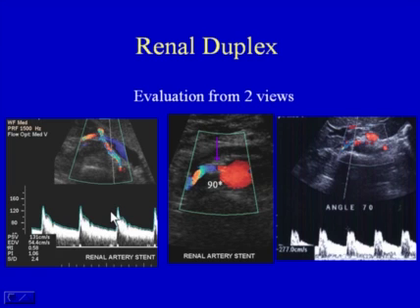Evaluating the renal arteries from two views, we will have multiple Doppler angles. However, if the Doppler angles are less than 60 degrees and the exam is consistent with stenoses from both views, the accuracy goes up. If you have a normal velocity from one view, and in this case we can see from the lateral decube approach, the right renal artery has a velocity of 131.